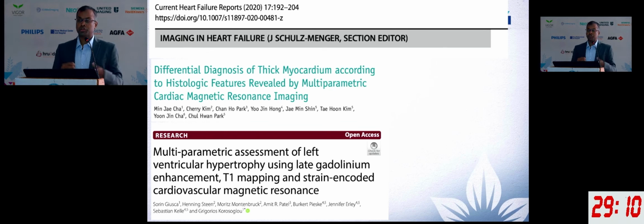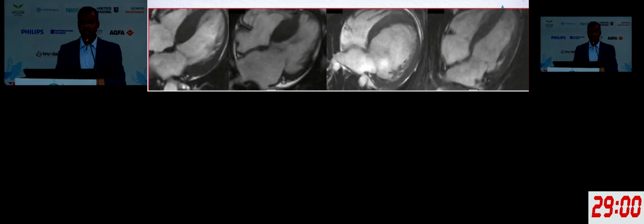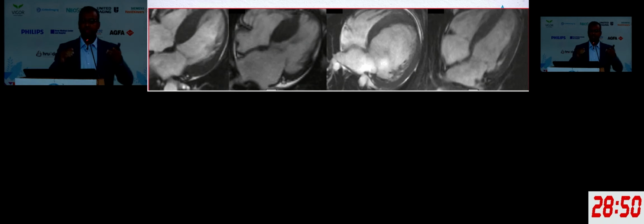Whenever I talk about cardiac MR to people who are new to cardiac MR, who are naive to cardiac MR, I show this slide. This is what echo is able to show today, that a patient has LV hypertrophy. We've got 4 different patients with different areas of LV hypertrophy, and that's where it stops with echocardiography or any other non-invasive modality, even with CT.